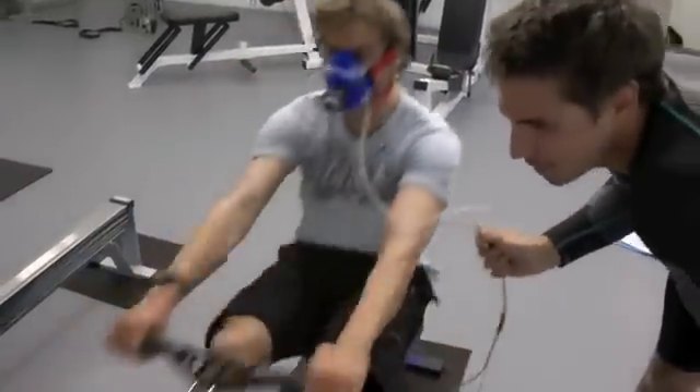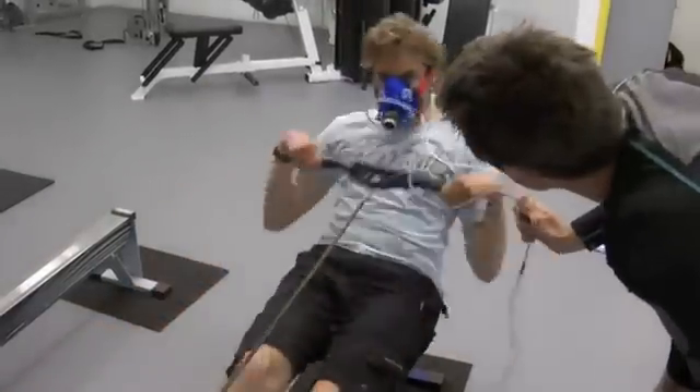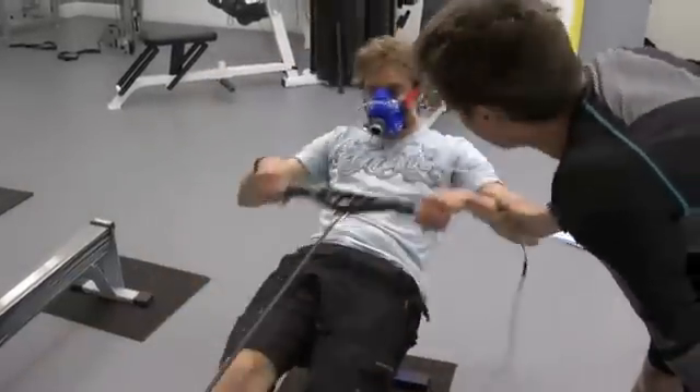Come on Simon, push it out. 10 seconds. Really hard, really hard. Keep it going, keep it going. Harder! Harder! Come on now. Harder than that. Keep it going. Well done.